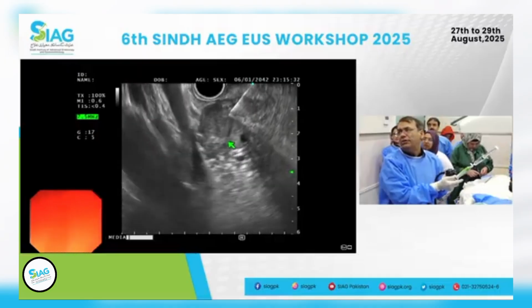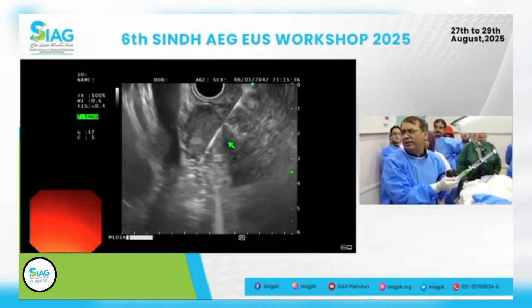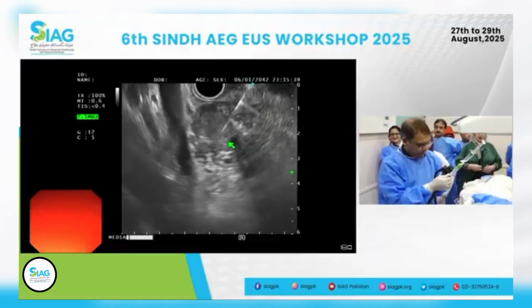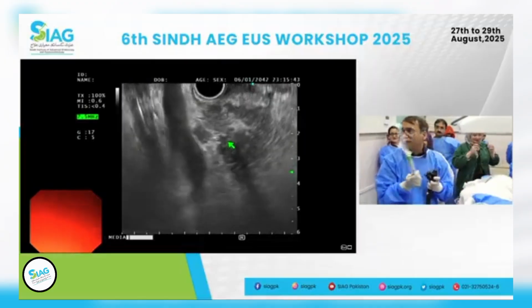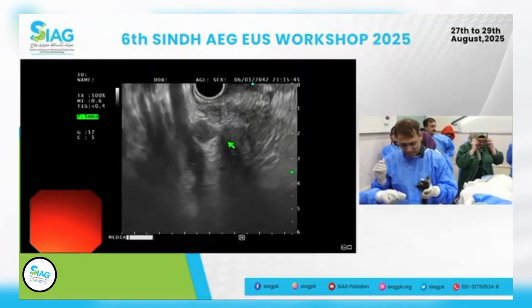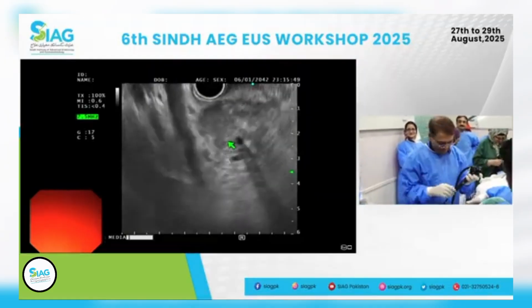So Wasim is saying that you did not do the specimen properly, and he tells me to use suction. But he's not happy. He's very unhappy over there in the corner. It's very difficult to make him happy. Yeah, I know, Khalid. Don't worry, ignore him. Okay. No, no. That's what I did anyway.